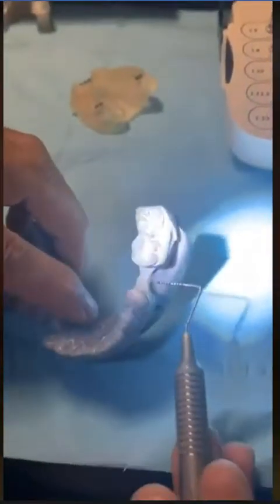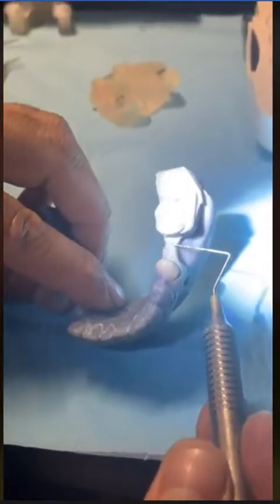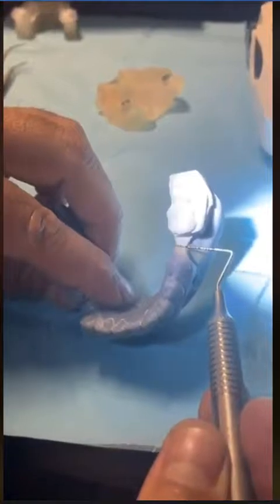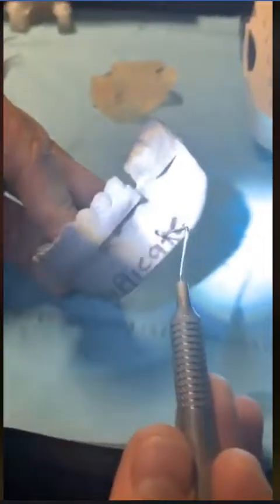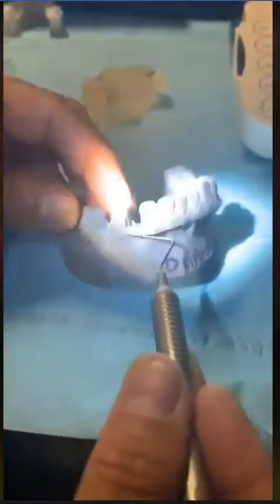So we have the guide, and now maybe you are able to see the indentation. Now, I would never put, let's take a look here. Look how thin this bone is on the coronal portion. Look how much the patient is missing here. So we definitely would never place an implant of 4.3 by 13 in this particular case. And look, you have your nerve over here, and we can indicate that. You could see where the nerve is. So you have all the information that you actually need on your live patient.